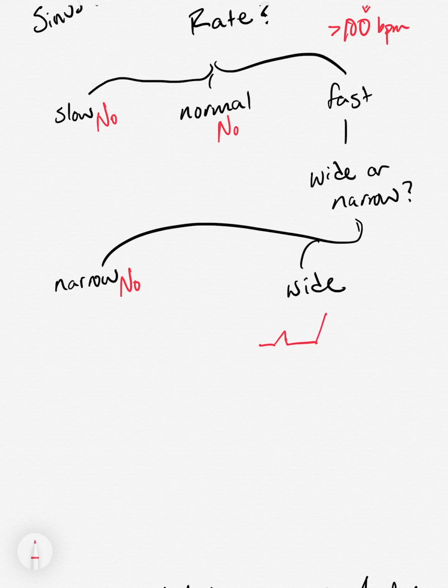So, here's a P wave. Here's a wide QRS, and here's a T wave. And I think I just said it, but it is the QRS complex that is wide in order to begin to answer this question and to form a differential. Okay, so how wide is wide then? And that is answered by the QRS complex has to last longer than 120 milliseconds.